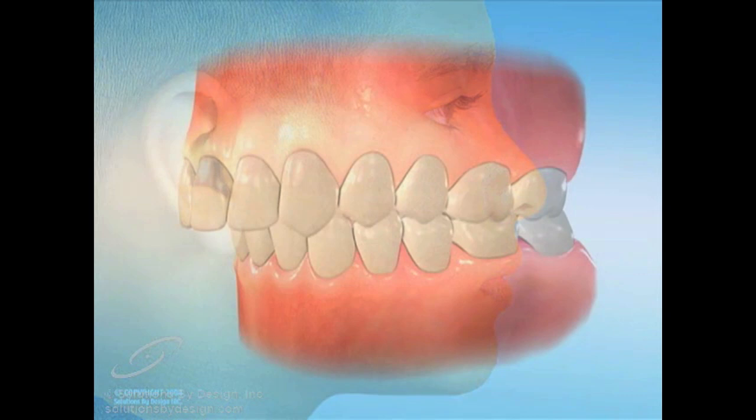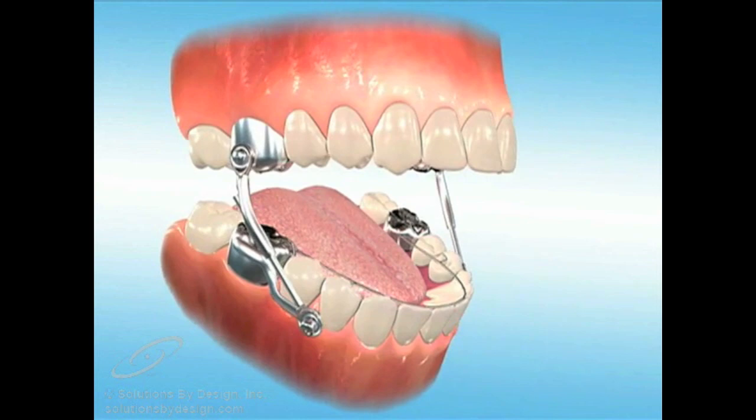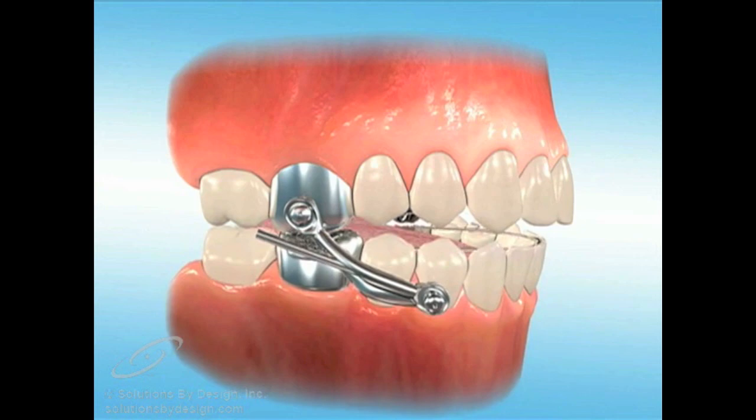A Herbst appliance is a functional appliance utilized by orthodontists to stimulate growth of the lower jaw. It consists of upper and lower crowns or bands with small rods attached to each. The crowns are cemented to the surface of your back teeth. The rods slide together connecting the upper and lower pieces of the appliance. This postures your lower jaw into a forward position.